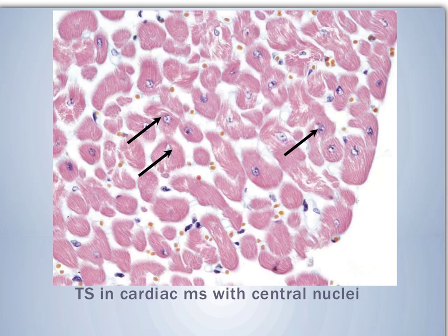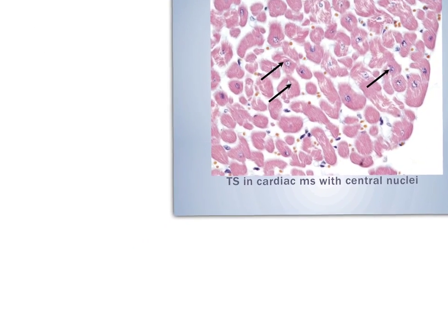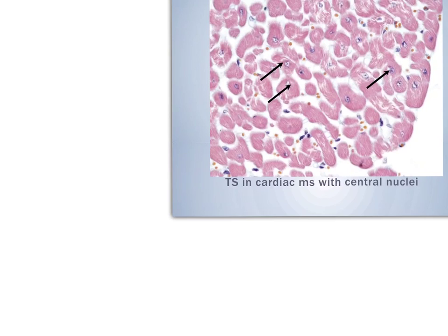You may be asked also about this tissue containing RBCs. This is the endomysium in between the individual muscle fibers. Also, you may be asked about some theoretical knowledge, like what is the size of the cardiac muscle fiber. Here the size is different from that in the skeletal. It is 15 micrometers in diameter. Also about the shape of the nucleus, it is a single, central, and rounded nucleus.